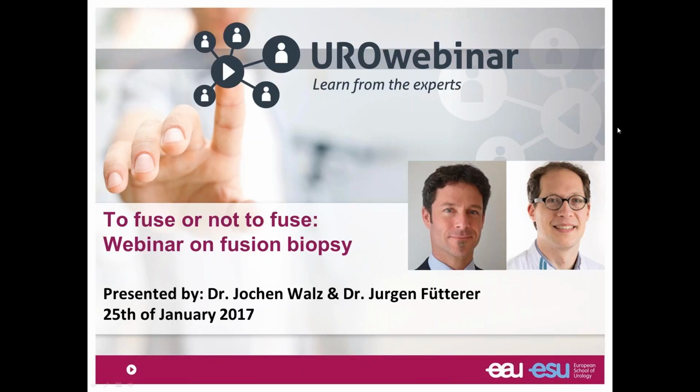We just recently published a small study where all patients had a negative MR before surgery and they underwent surgery, and we could show that in these patients quite a high number had indeed significant cancers. We also did a quality evaluation, comparing the expert MRs with those coming from somewhere else, and we could show that if the MR is negative and done by an expert, then there's a low likelihood that you miss substantial disease. You still might miss some small volume high-grade cancers, which are the most challenging cases, but you will probably rule out the presence of high volume high-grade disease if it's done by an expert.